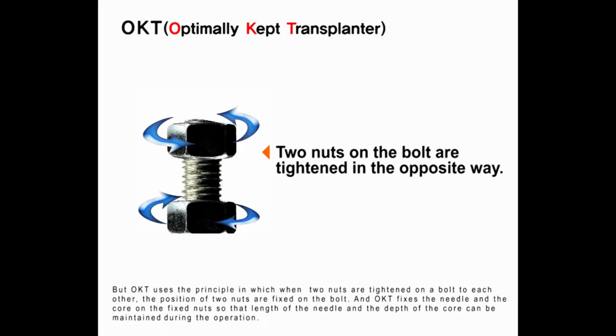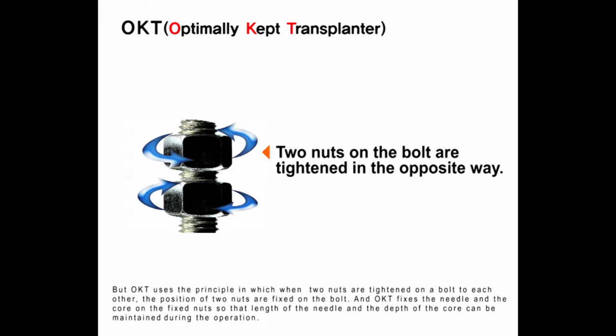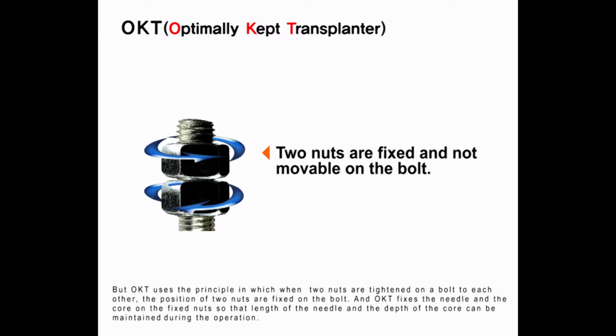But OKT uses the principle in which when 2 nuts are tightened on a bolt to each other, the position of the 2 nuts is fixed on the bolt, and OKT fixes the needle and the core on the fixed nuts so that the length of the needle and the depth of the core can be maintained during the operation.